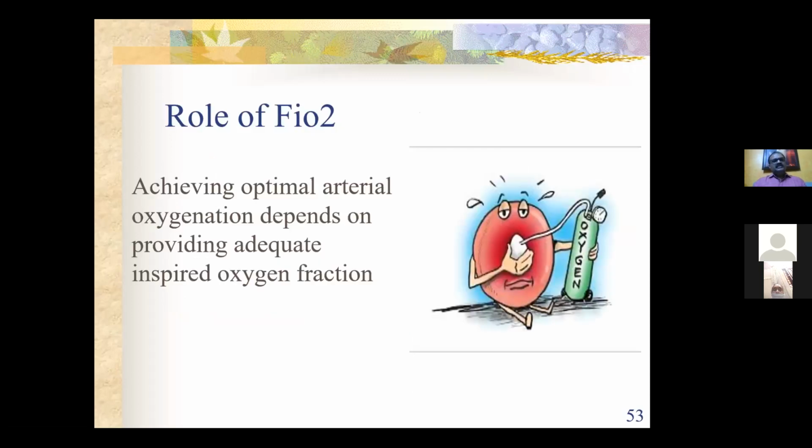What is next? So basically, the next one, once we have selected the tidal volume, is the FiO2.